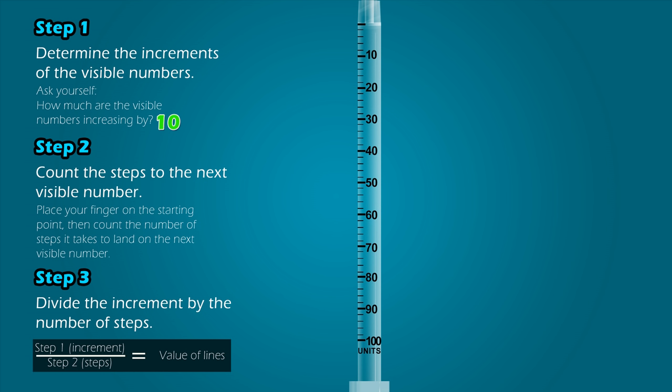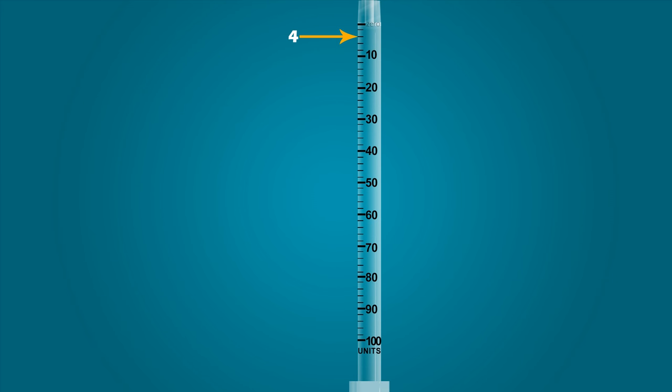Step 2: Count the steps to the next visible number. Our starting point is 10, and it takes 5 steps to land on the next visible number. Step 3: Divide the increment by the number of steps. When the increment of 10 is divided by the number of steps, 5, it equals 2. Therefore, each line on the syringe represents a value of 2 units. This line is 2, this is 4, 6, and so on.